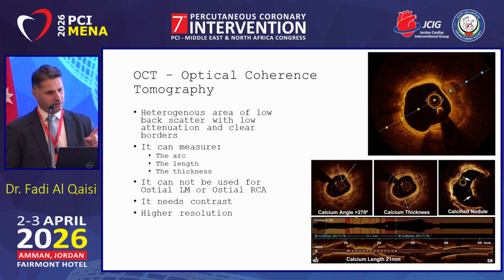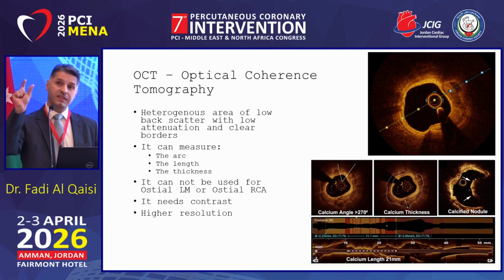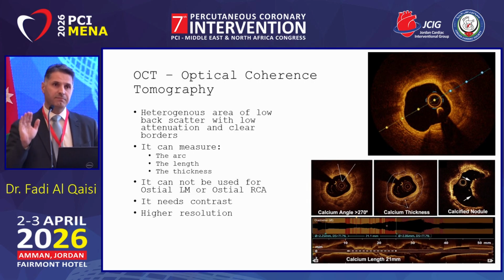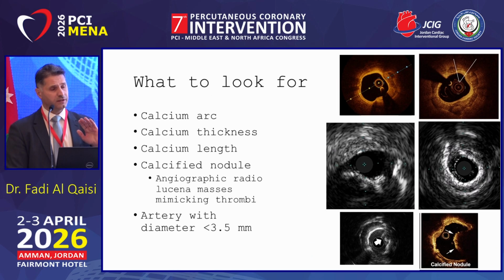OCT, which is not available in Jordan, optical coherence tomography, it shows us the attenuation, low back scatter, low attenuation, like this one. It can measure the arc, can measure the length, but it can also measure the thickness of the calcium because this can penetrate beyond the calcium. It cannot be used for ostial left main or ostial RCA because it needs contrast. You have to inject contrast to clear the artery from any blood so you can see the calcium properly. And it has superb resolution.